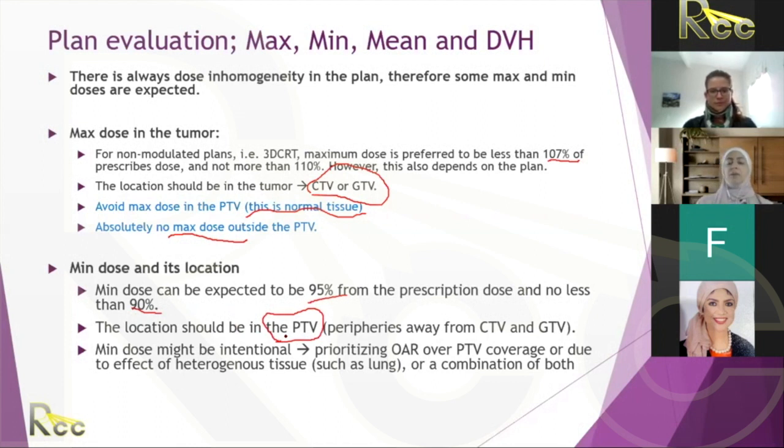In other words, if I am compromising a little bit from prescription dose, that should be in the PTV. And there is a reason why sometimes you compromise, and we'll come to that later on. This is important, so I have to say this again in Arabic.